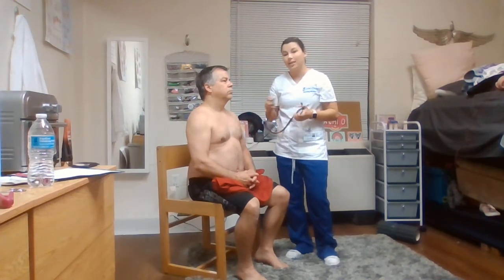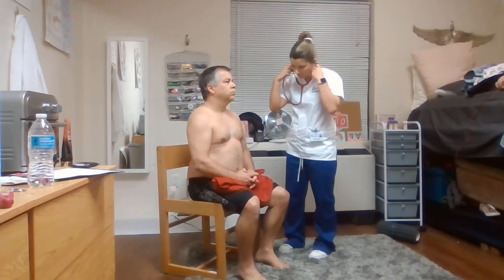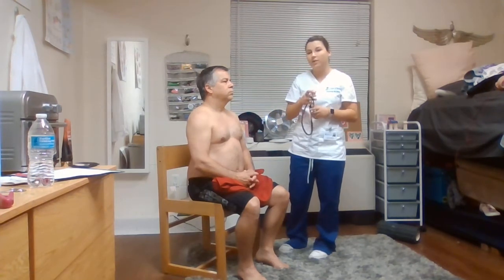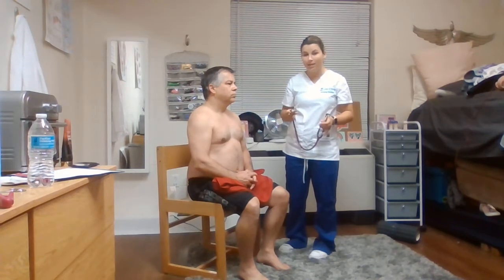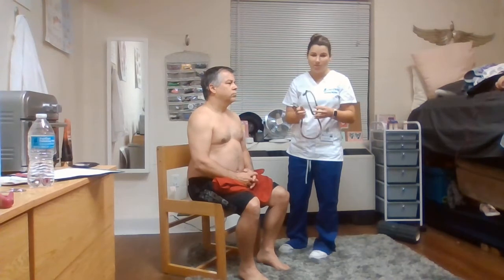All right, and at this second intercostal space on the left sternal border, I'm going to be listening to his pulmonic valve. Right, I'm going to move down an intercostal space to Erb's point to listen to the second pulmonic sound. And if I heard any murmurs at any point, I would switch to the bell of my stethoscope instead of the diaphragm to listen for murmurs, because it can detect low frequency sounds better.